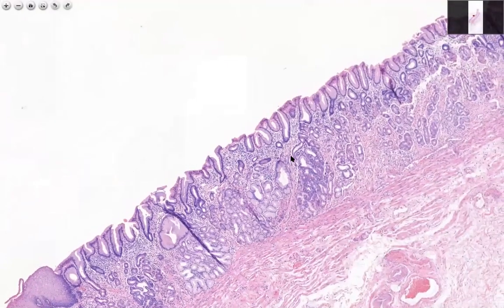The gastric cardia and the last part of the stomach, the gastric antrum, have similar histologies, and so often we discuss those as one type of gastric epithelium, whereas the gastric body fundus, which takes up about 90% of the stomach and is in charge of the acid secretion, has a separate but uniform histology, and we can take a look at that first.